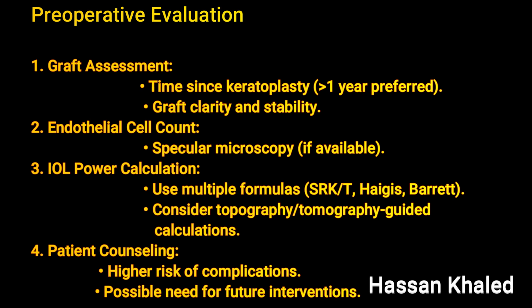Preoperative evaluation includes graft assessment and the time since keratoplasty, which should be more than 1 year, and doing specular microscopy to check the endothelial cell count, using multiple formulas for the IOL calculation, and counseling the patient properly about the higher risk of complications or graft rejection.